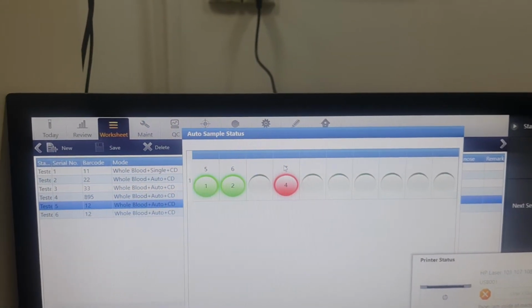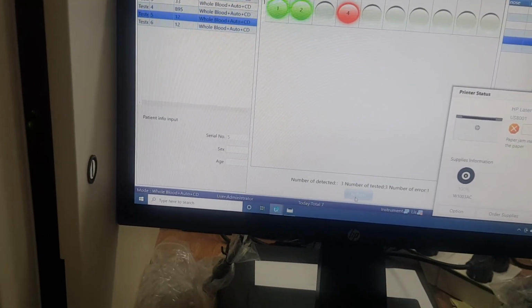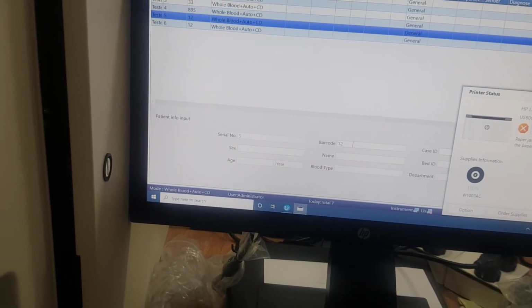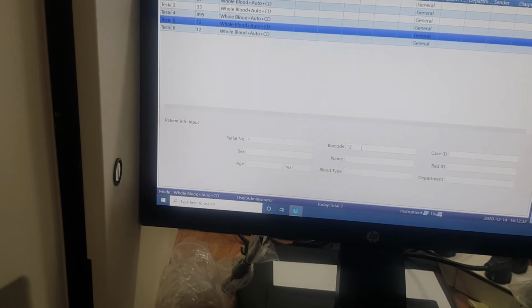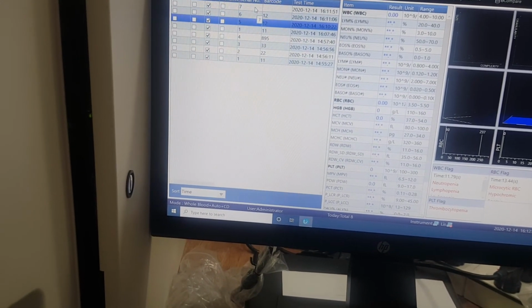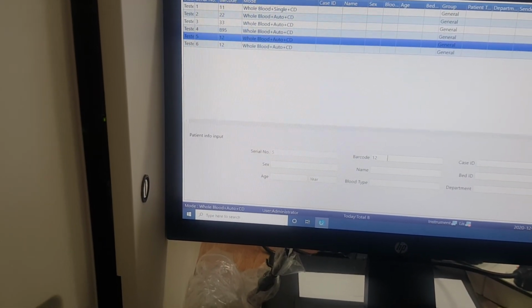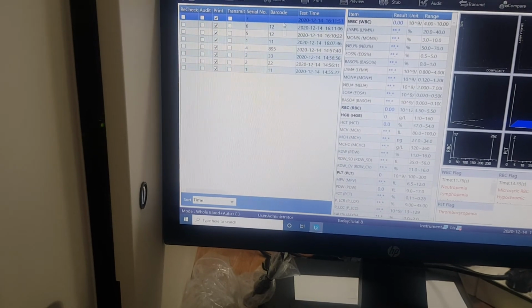but it comes to position 7. See, position 7, there is no ID. There is no barcode in position 7, so we don't have any barcode in position 7.